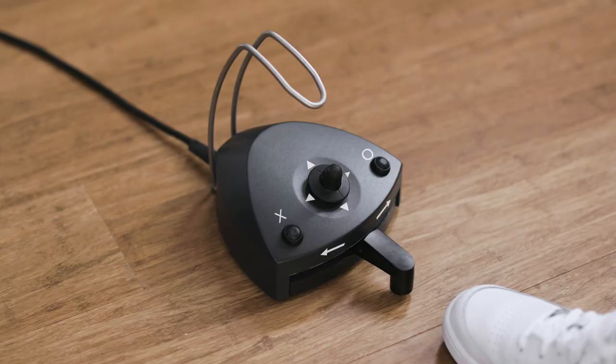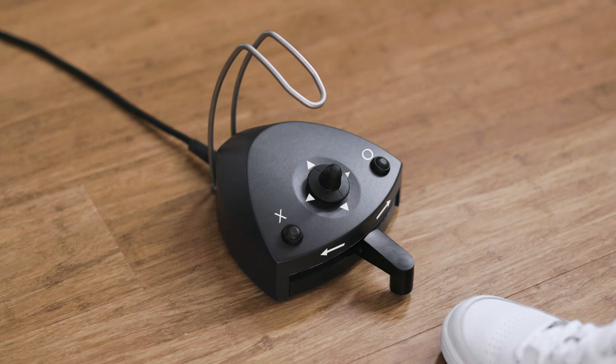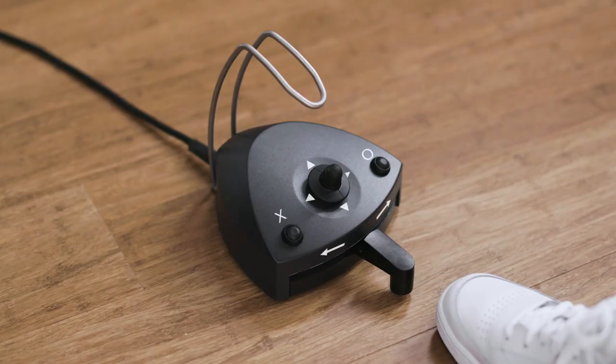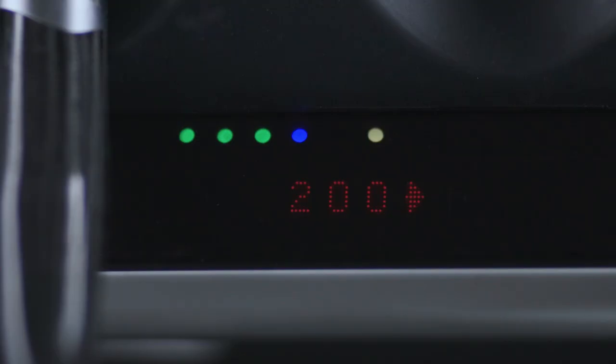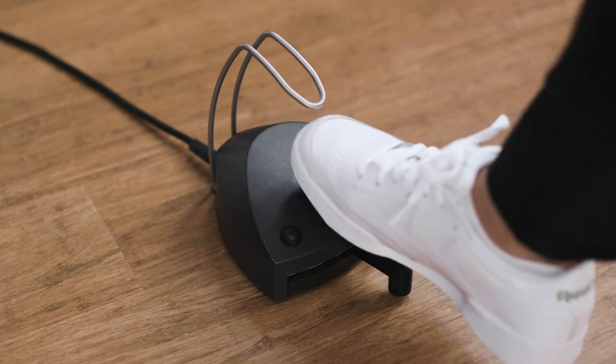Switch irrigation on and off by tapping on the left button X. Choose between three levels of irrigation. The amount of irrigation will increase when you move the joystick east, and will decrease when you move the joystick west. You can choose between three maximum speed levels — the maximum speed will increase when you move the joystick north, and will decrease when you move the joystick south.